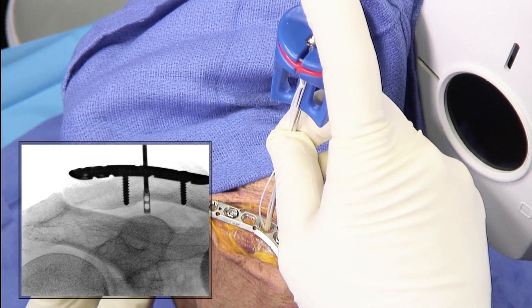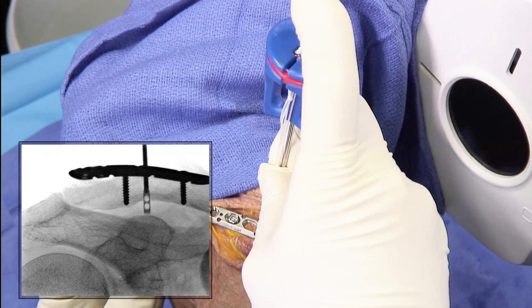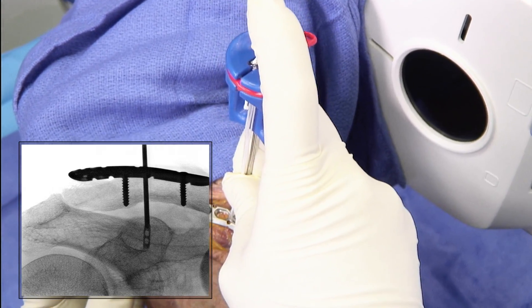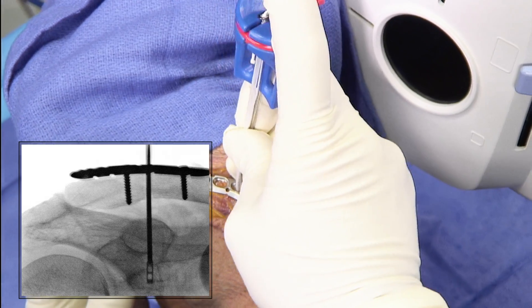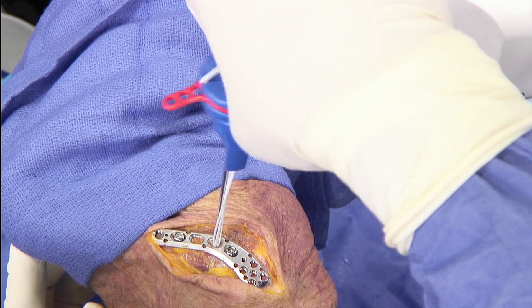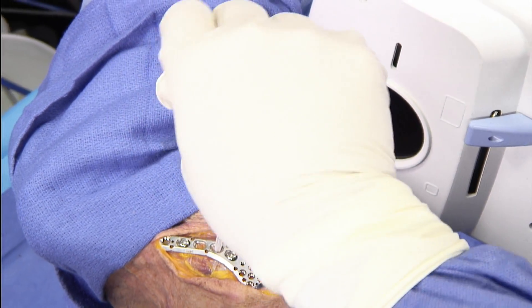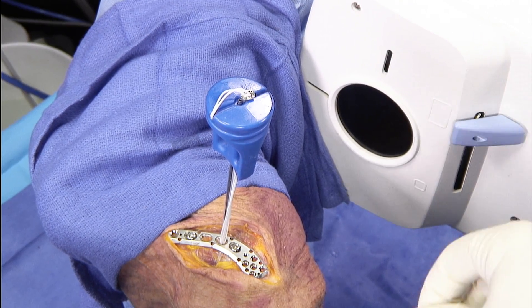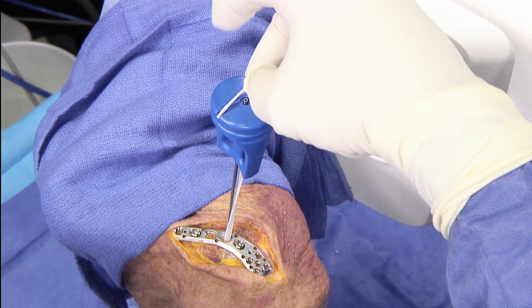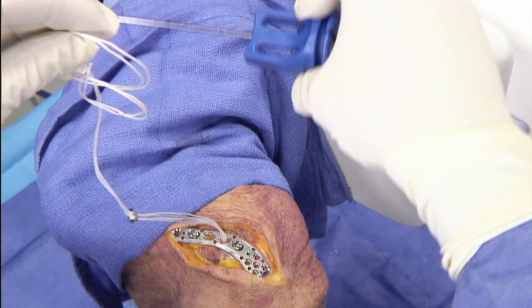On fluoro we can see we've gone through the clavicle and entered the coracoid. As we pass it down, we're passing through the coracoid — there, we've passed through the coracoid — and now we can release our button. We unscrew the threads, take out the pin, remove the red grommet that protects the sutures, take the button out of its little holder, undo the sutures, and remove the handle.